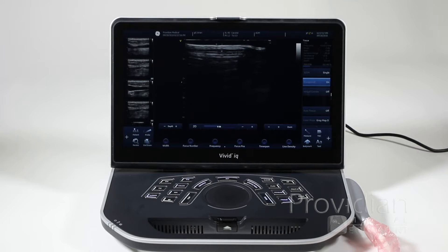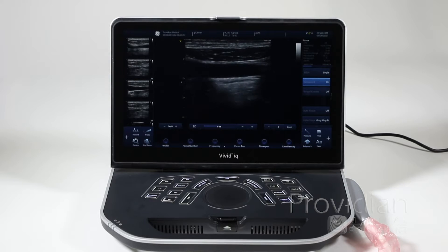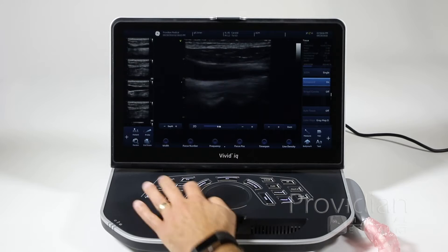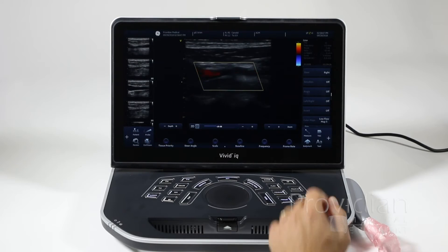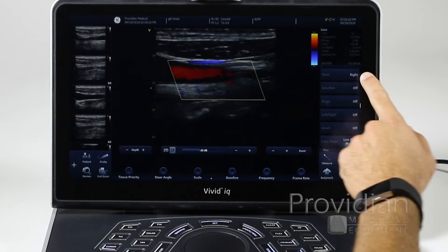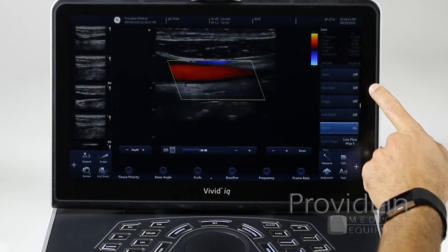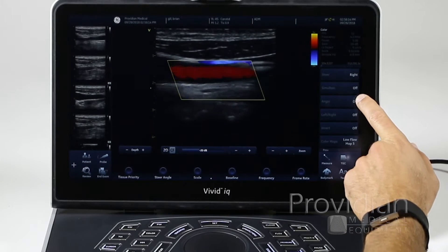For color and PW Doppler, there's quite a bit that can be done here. Let's start off with some color imaging. You can press the color button and you get your box. Here you have a whole new slew of things you can change to steer left, right, and off.